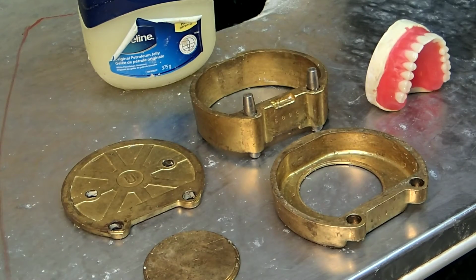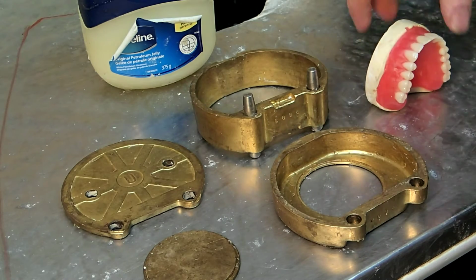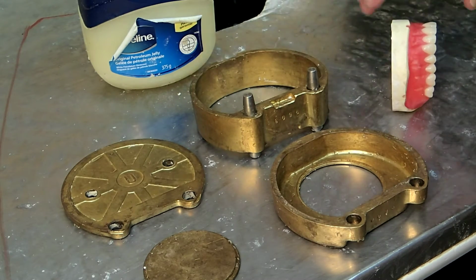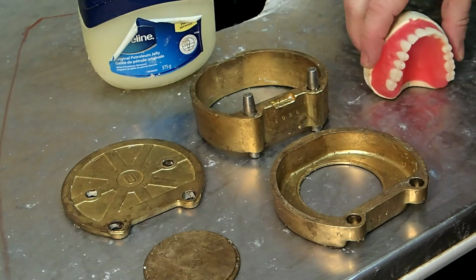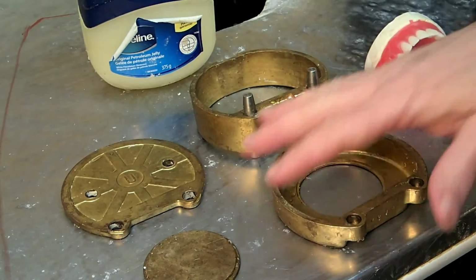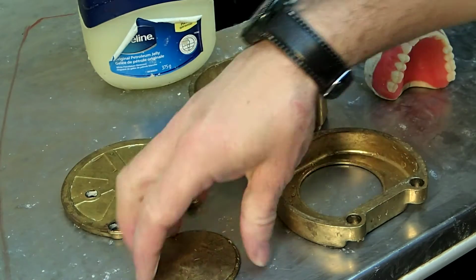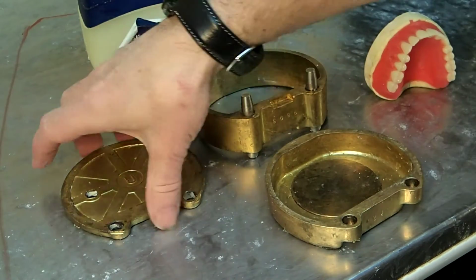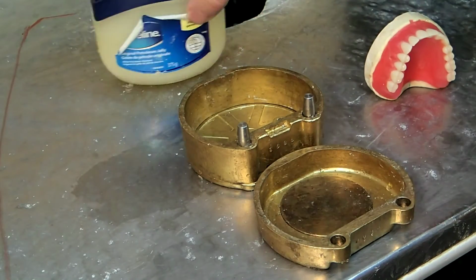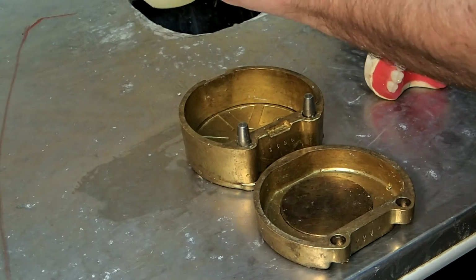To do a first stage flasking on a full upper denture, I need my full upper denture wax up, all nice and clean, ready to go, everything smooth, no wax on the teeth. I need my flask. The flask has 4 parts. It's got a bottom, a top, a knockout plate which goes in the bottom, and a lid which goes on the top.